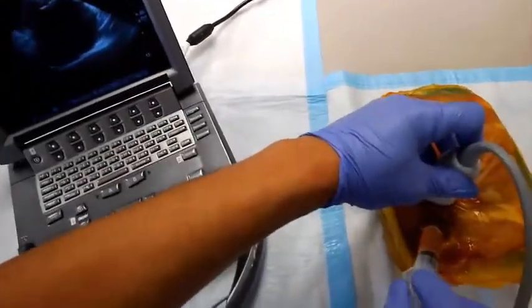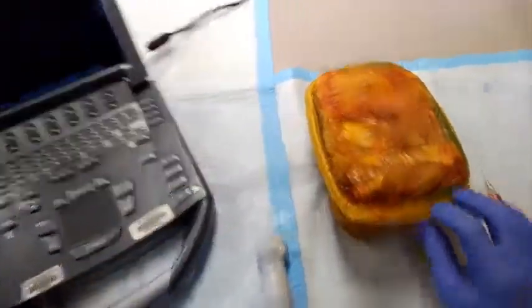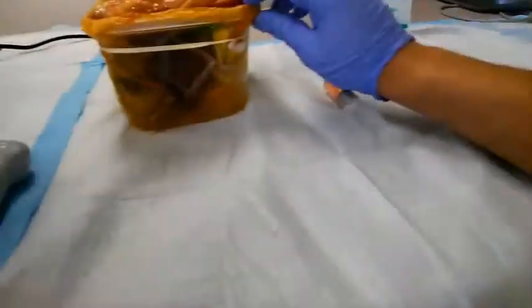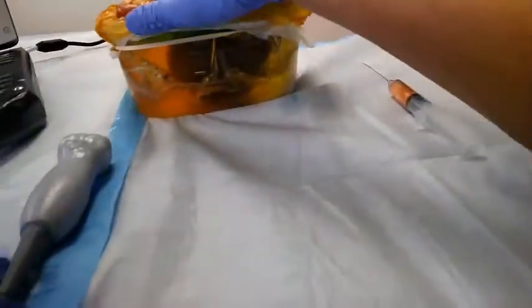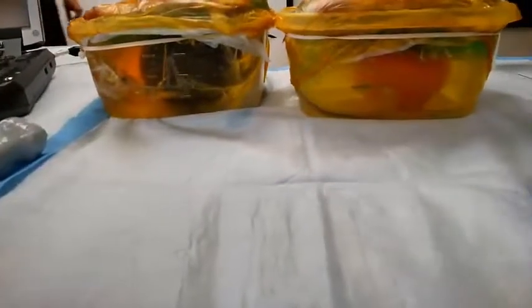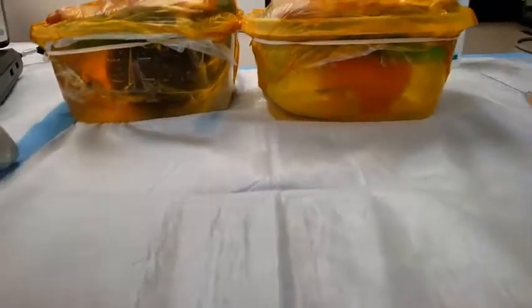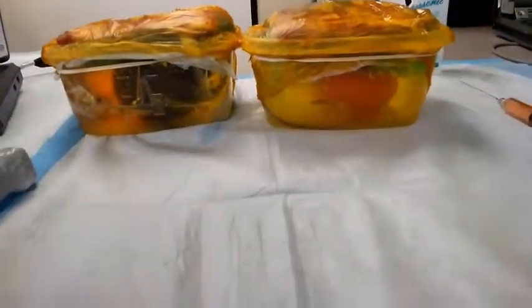The other thing you can do is if you remove the needle, if you look on the bottom of the case, what was normally yellow is now turning red. As you compare it to one that was already made, you see the difference — one is more red than the other. And that's how you use our pericardiocentesis model.